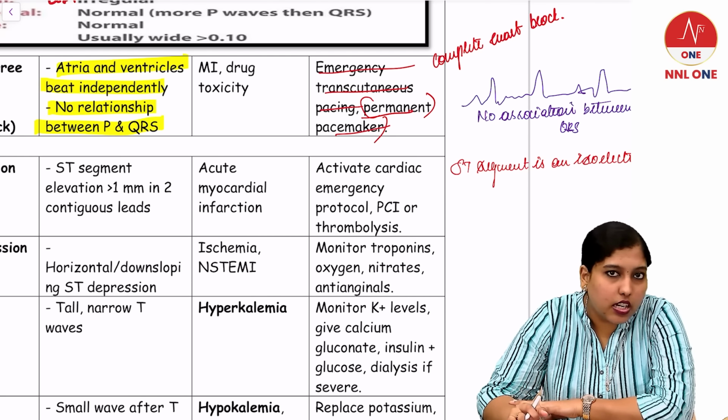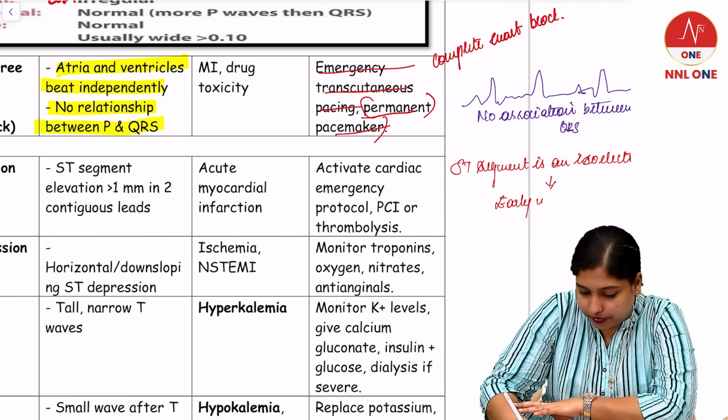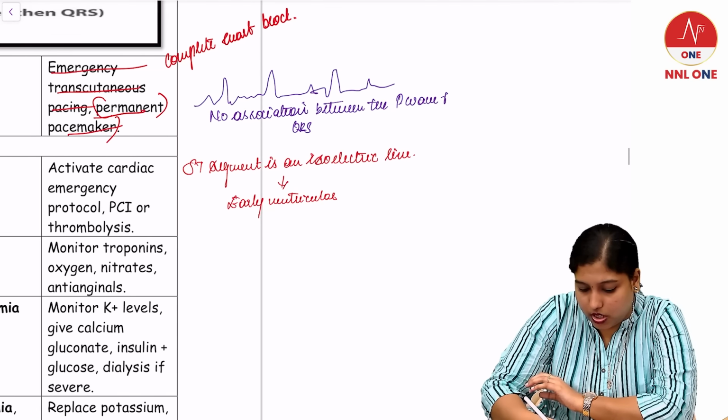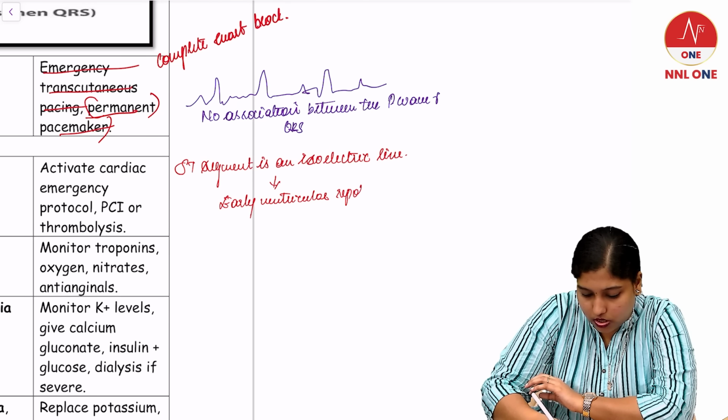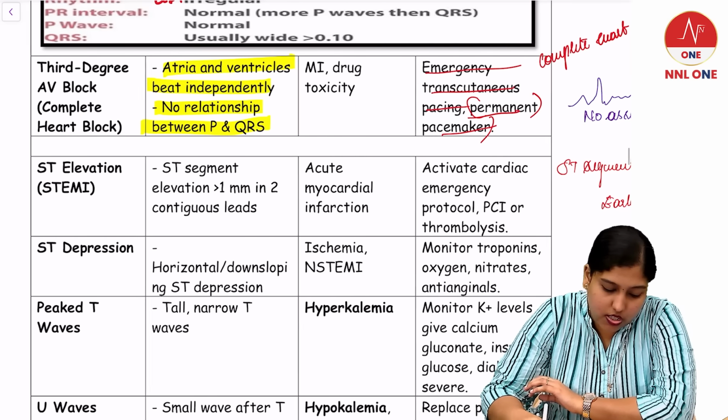It is an early ventricular repolarization state. Early ventricular repolarization state, right?